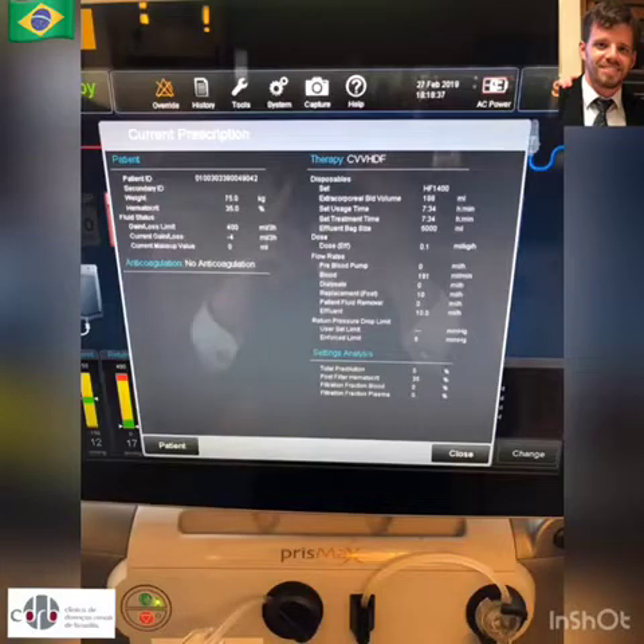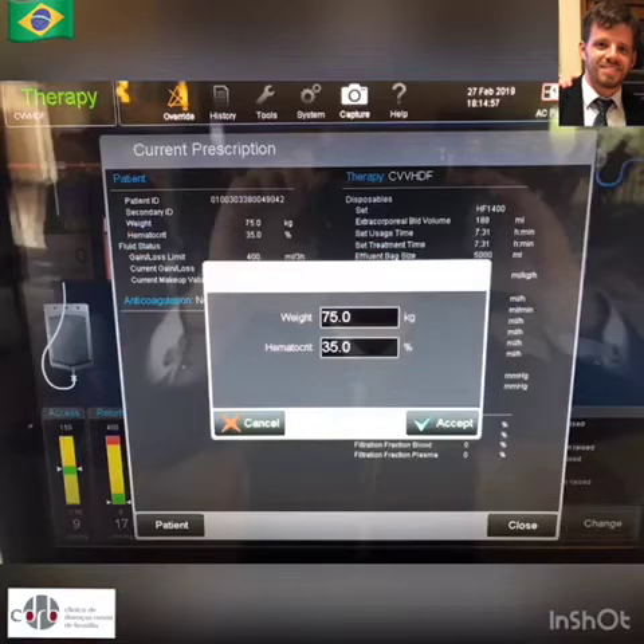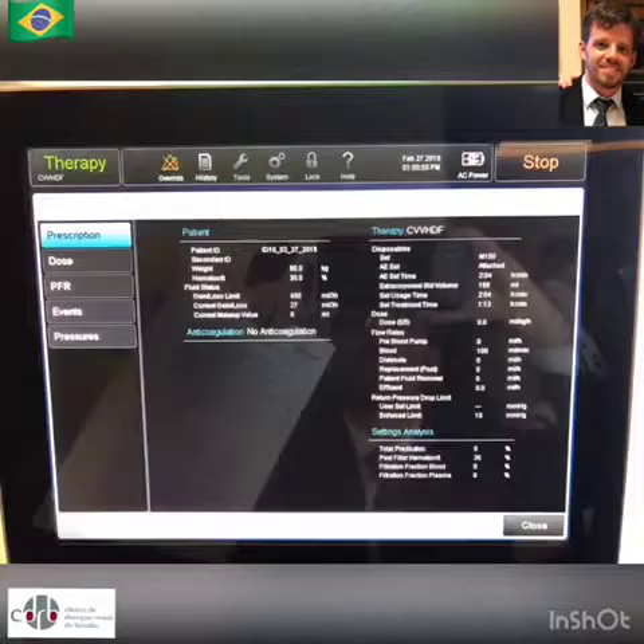Here is your patient and treatment information. On the bottom right, you can see the filtration fraction.